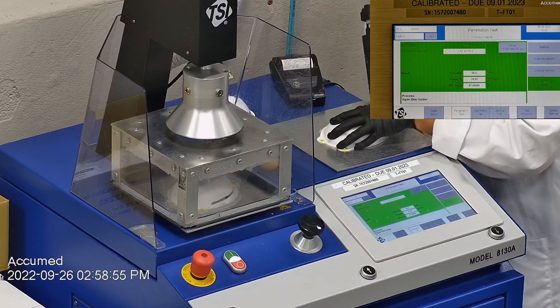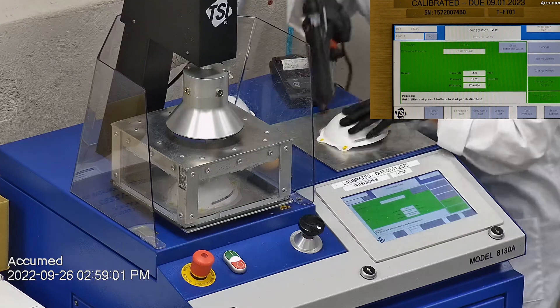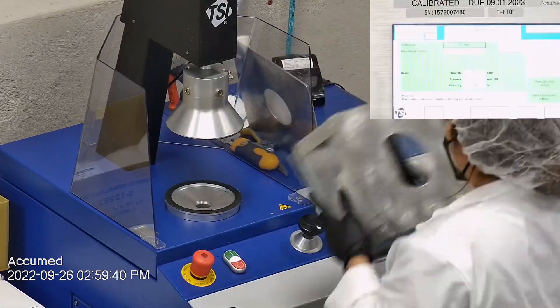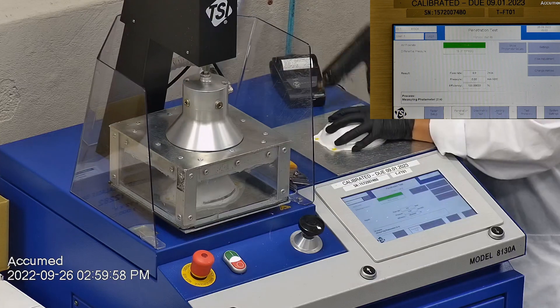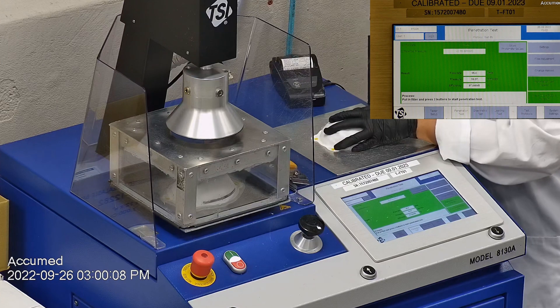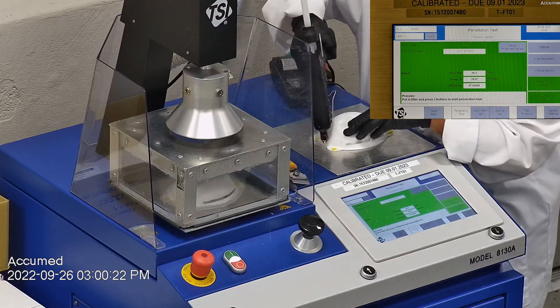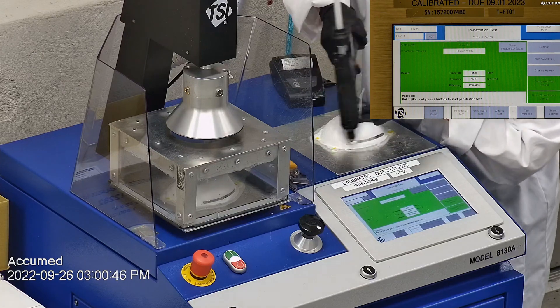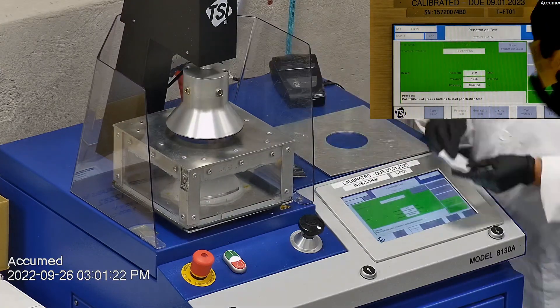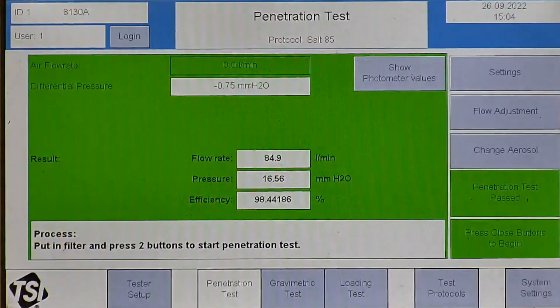The first sample had a filtration efficiency of 97.94% and a pressure drop of 15.1 millimeters of water. The second sample had a filtration efficiency of 97.84% and a pressure drop of 15.1 millimeters of water. The last sample had a filtration efficiency of 98.44% and a pressure drop of 16.6 millimeters of water.